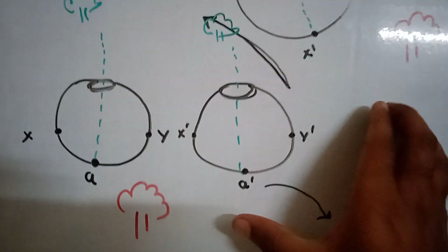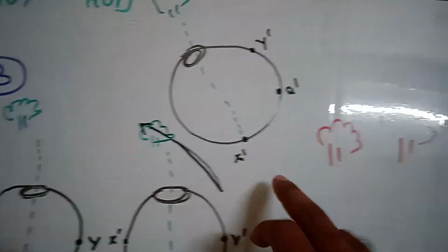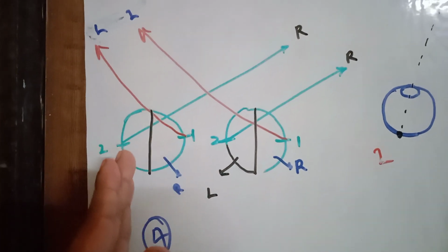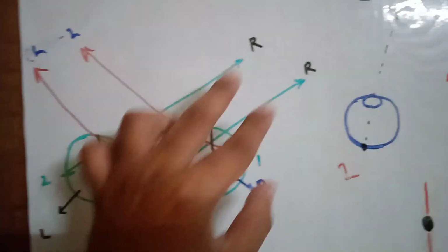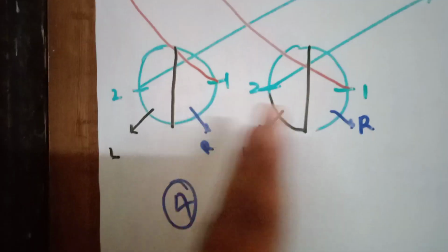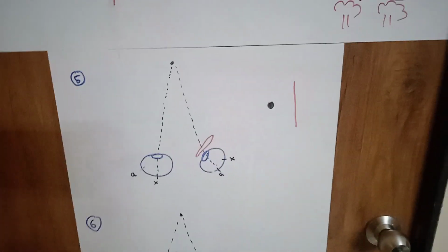Similarly, you turn the eye like this, and now the image falls on X, and again you will see two trees. Now look here. A very beautiful thing about the eyes: you have two eyes and each eye has two parts. The left part of this eye and the left part of this eye both look in the same direction, and the same is true for the opposite. So all the information from the right side comes to the left hemiretinas of both the eyes. Similarly it is true for that side. Everything now makes sense when you do the test.